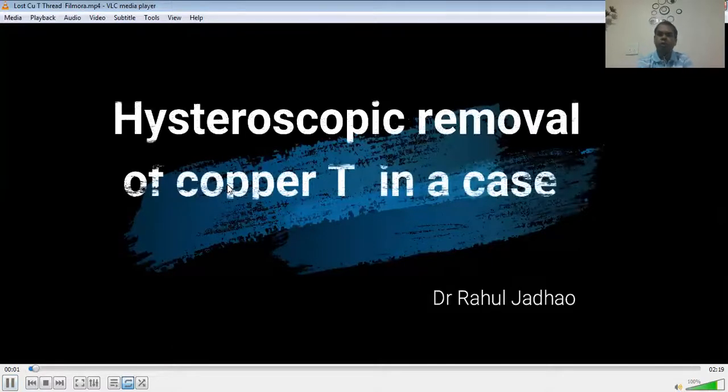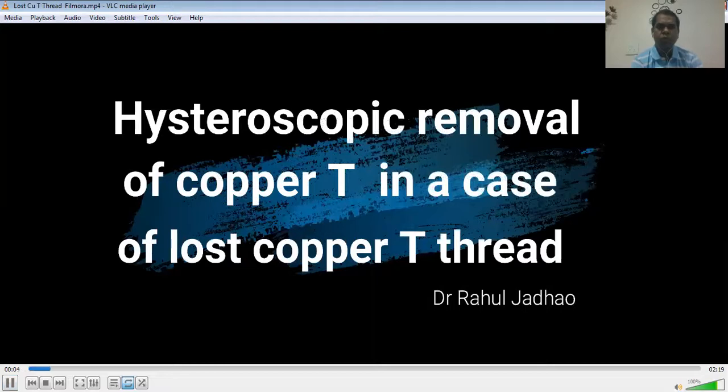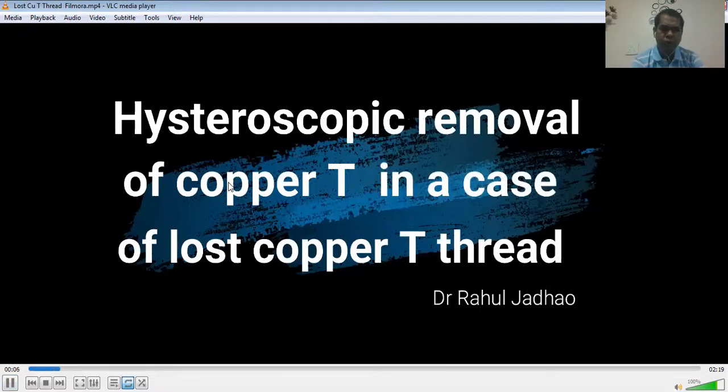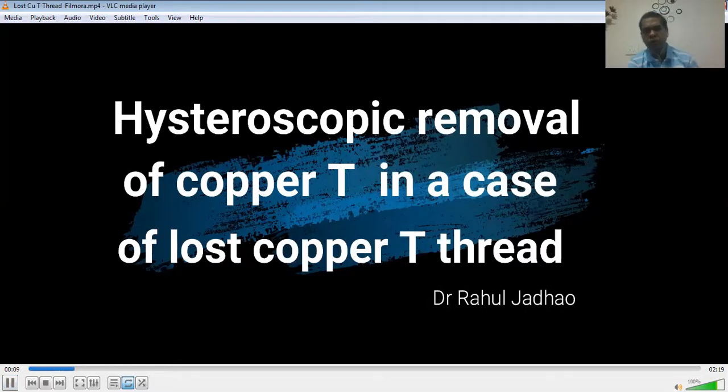This patient was referred from primary health center with non-visualization of copper T thread. The copper T was inserted two years back.